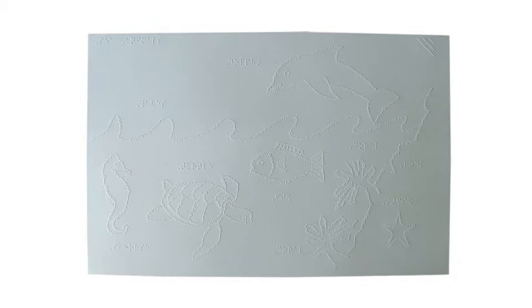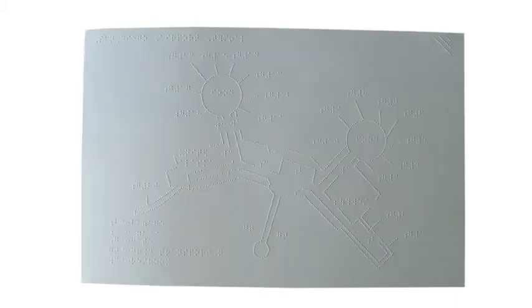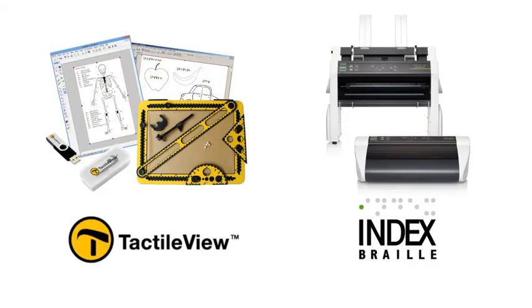With all of the possibilities, it's easy to see why the TactileView Design Suite and Index V4 Embossers are becoming the standard for accessible tactile graphics creation.